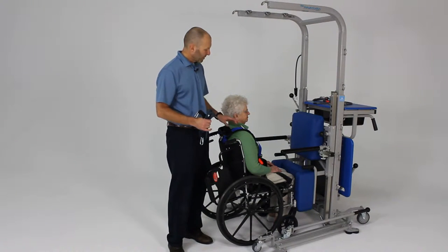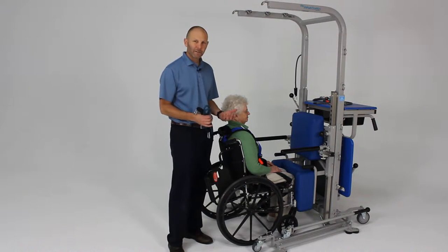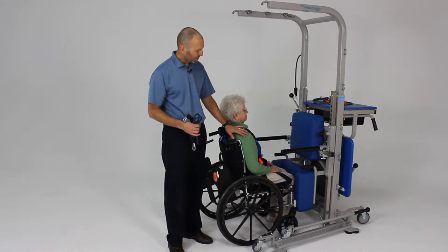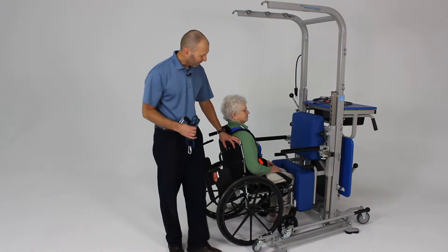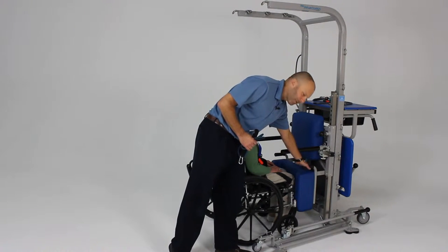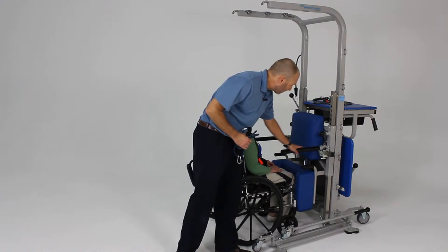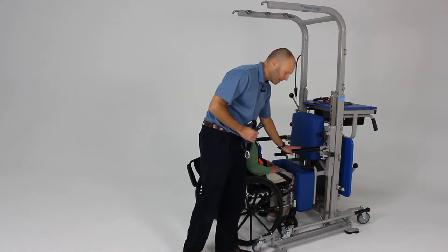For a patient who's just having difficulty with basic sit-to-standing ability and also just standing tolerance, one thing we can do is set them up in a nice environment that makes it conducive to some safe sit-to-stands and transfers. In this case we have the patient pulled up in their wheelchair. We've got the optional knee pad — a separate accessory that can be added to the unit to provide a block for the knees. We have the arm supports in the down position so they feel like they've got something to help pull up with or to use for support and stability.